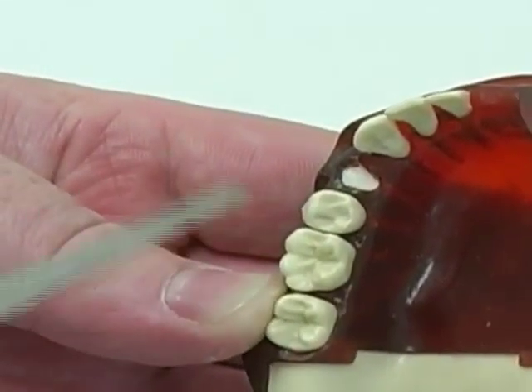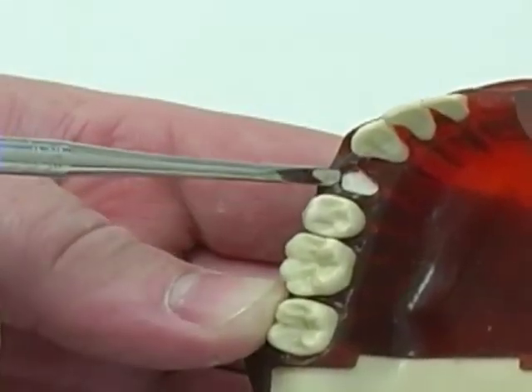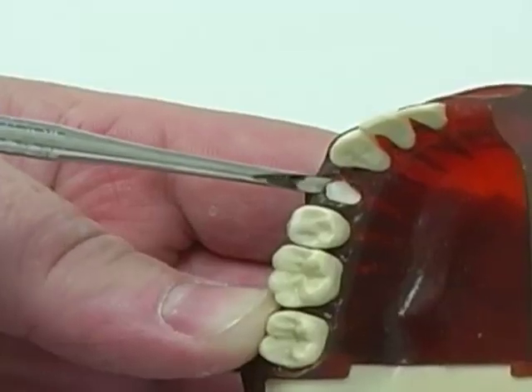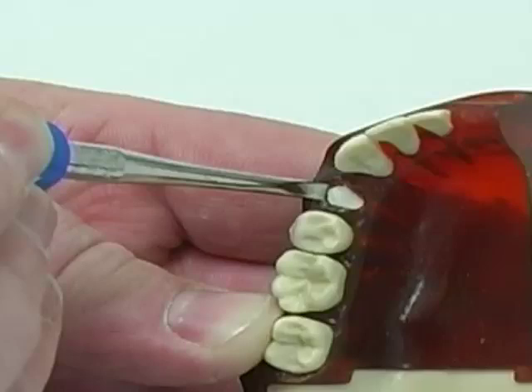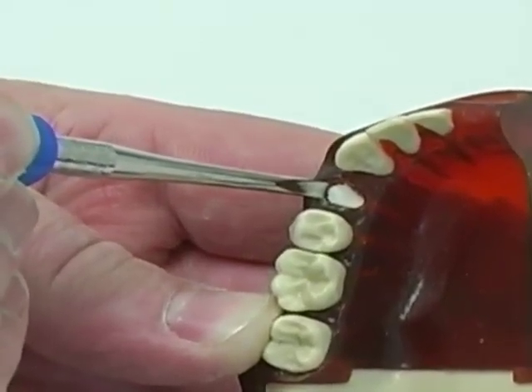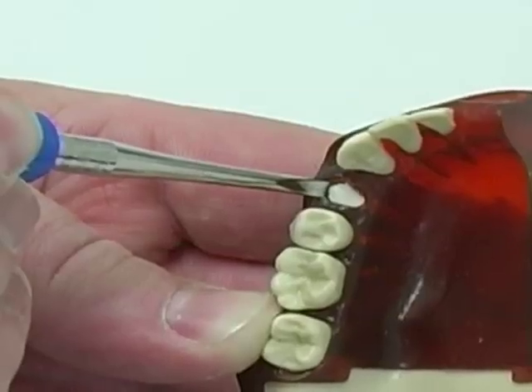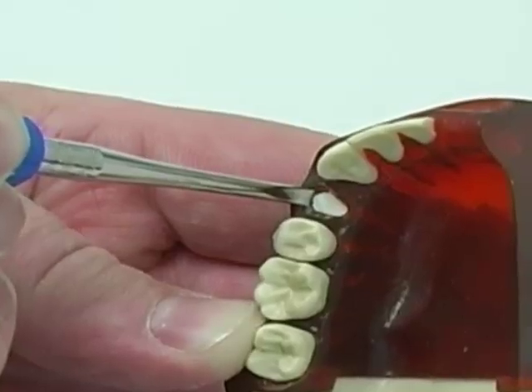The luxator is placed vertically in apical direction and squeezed in between the bone and the root. You can squeeze very hard in apical direction, except in the posterior upper jaw where the sinus may be close — you have to be more careful. The instrument is squeezed in between the bone and the root.